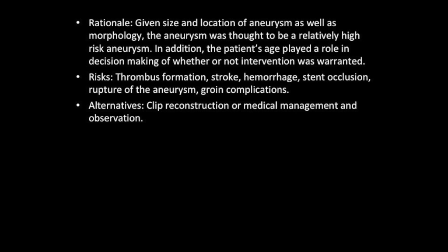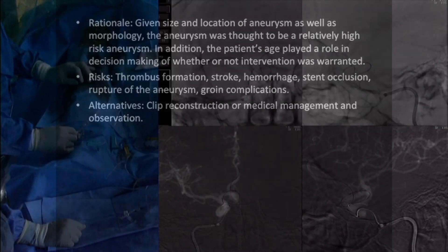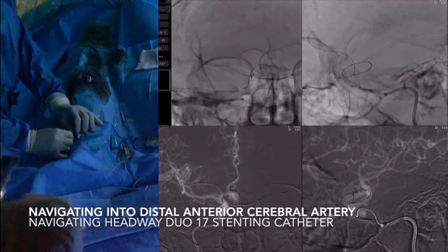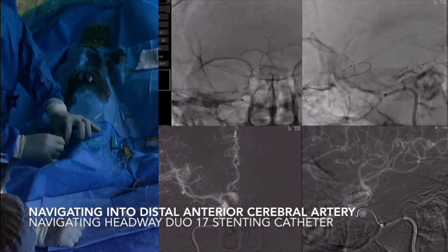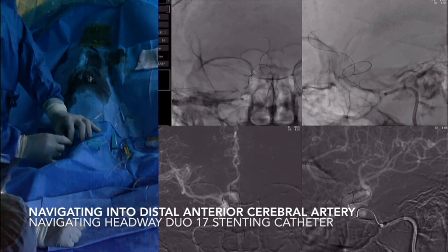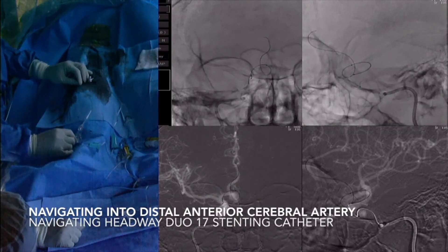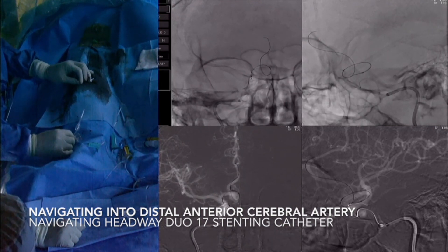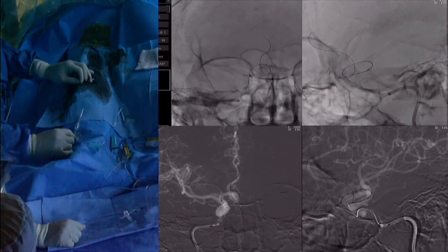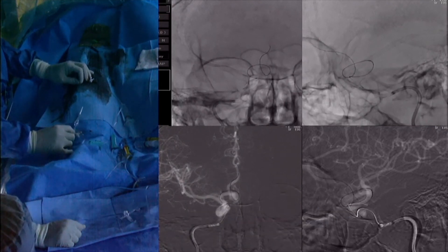Given the patient's age, we elected for stent-assisted coiling. Given the tortuous anatomy, in order to access the A2, we had to loop the wire and the microcatheter inside the aneurysm using a roller coaster or loop-de-loop technique.